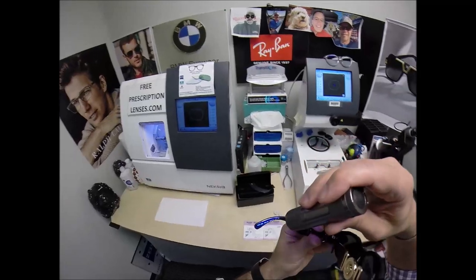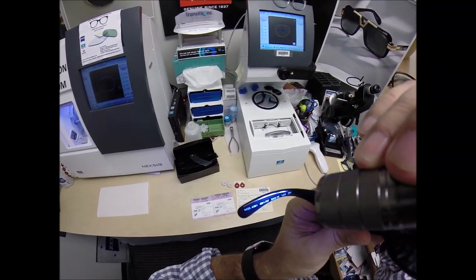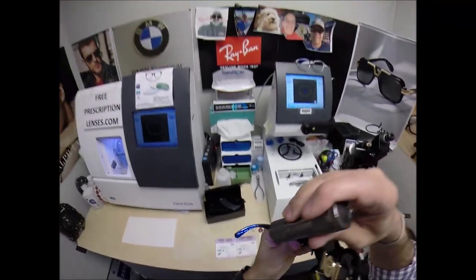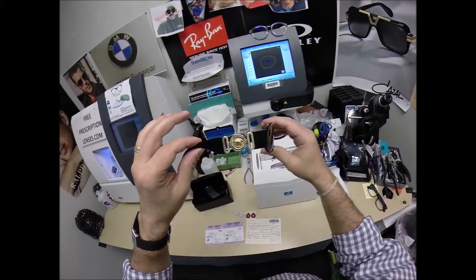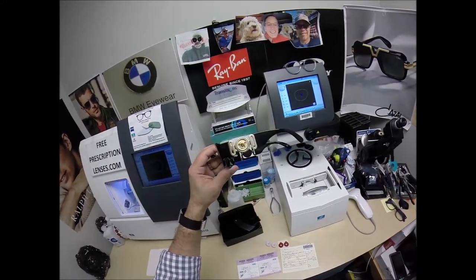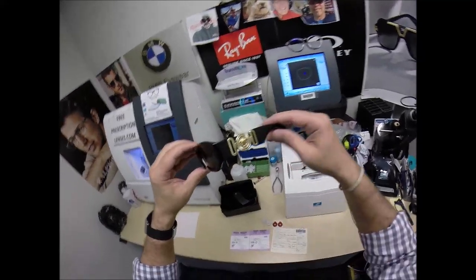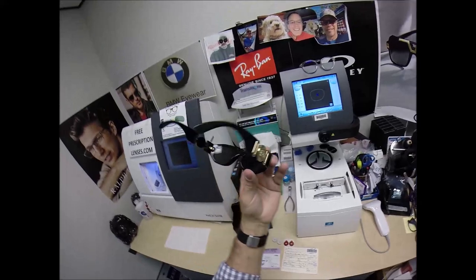This is the Versace 4361, color GB1, in the 53 eye size. It's got an 18 bridge and 140 temple link. The color GB1 is the classic black and gold. This is returning back to the vintage look — how they looked back in the day. Going old school on a Versace. The Medusa inside — those are nice.